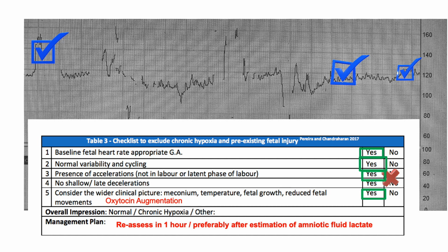the uterus has lactate due to excessive contractions, that has resulted in poor progress of labor. Using oxytocin in that situation is not a good idea. In such situations, if the amniotic fluid lactate level is more than 10.1 millimoles, we may have to rest the woman with hydration and start oxytocin after retesting the amniotic fluid lactate.